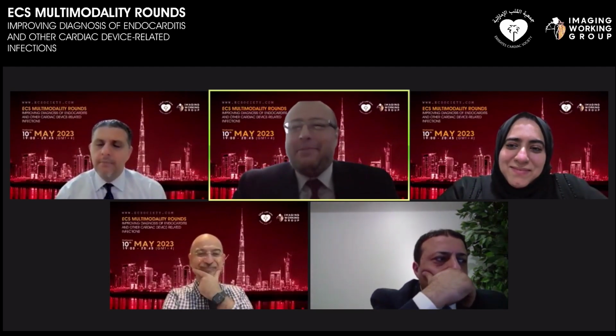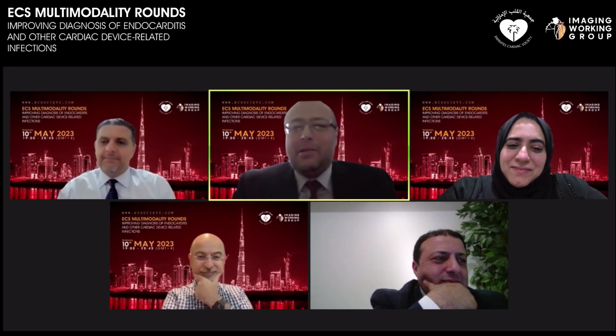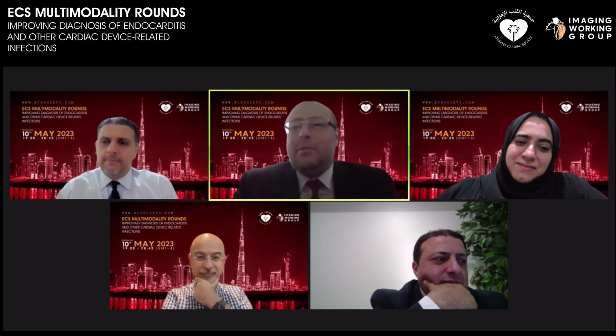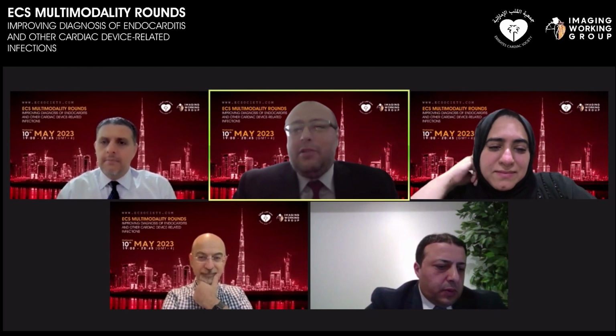So you're asking all the relevant questions. I know you're asking them for the audience, and this is very helpful. So this is the real threat here, obviously. You don't want to have non-diagnostic studies or cases that are falsely positive. It is a normal physiologic uptake, and then you end up calling it infection because you think that it is not. So the way we do it, actually, two things.